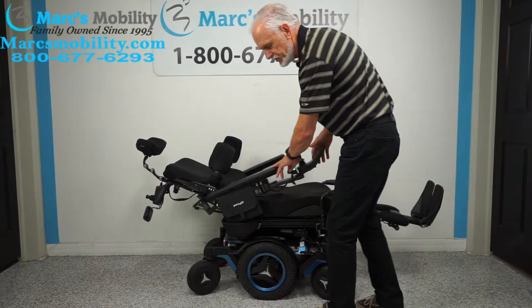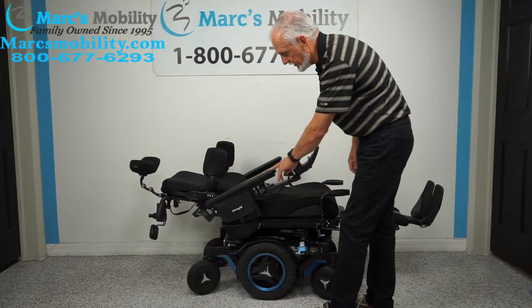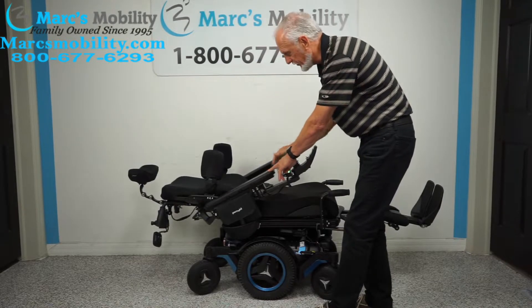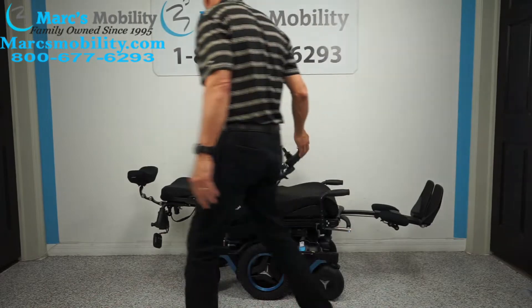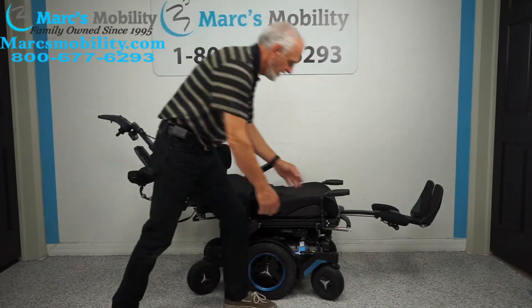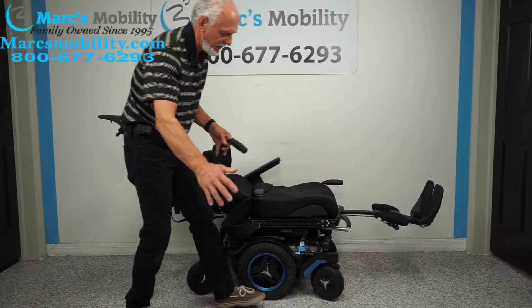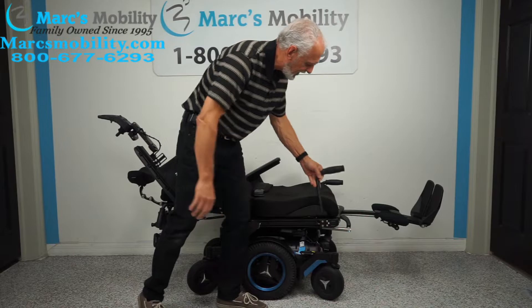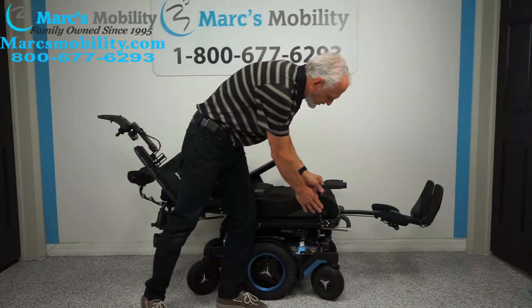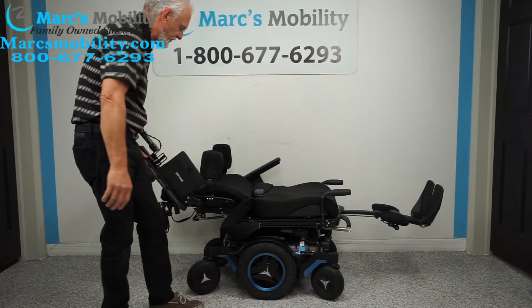By the way, this chair only has 13 miles on it — I forgot to mention that at the beginning. Notice how the arms flip up, so if you transfer from the side you can remove the armrest and transfer using a sliding board from the side. You can definitely do it on this chair.